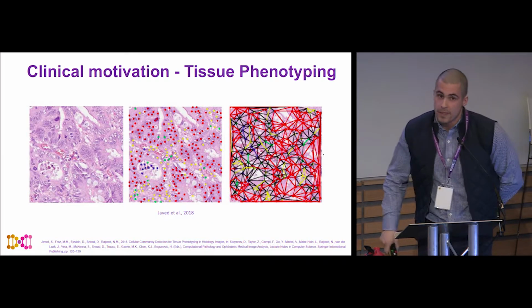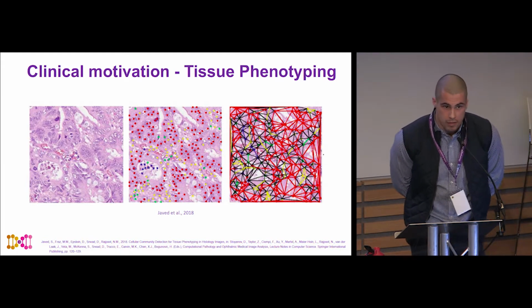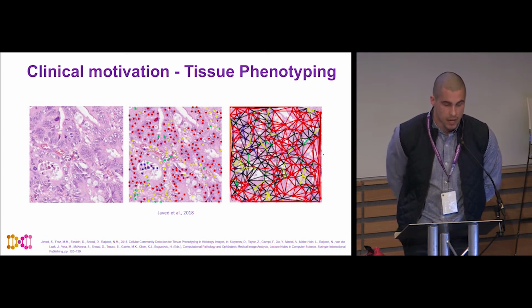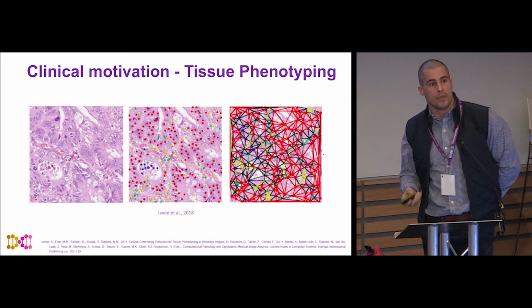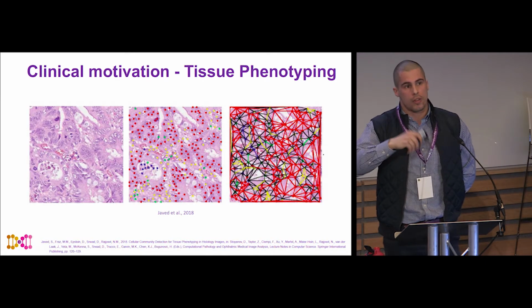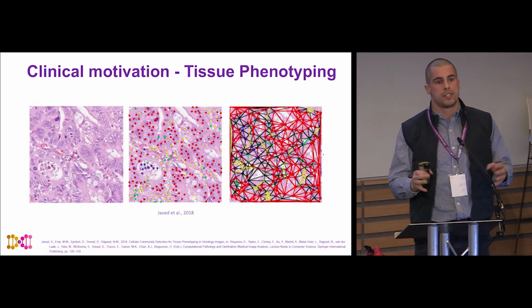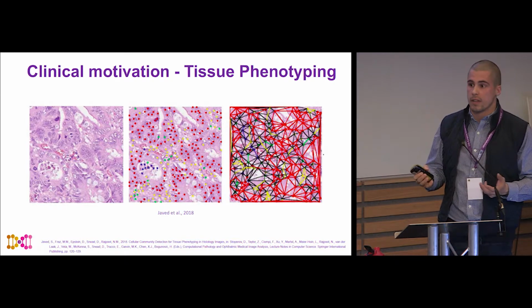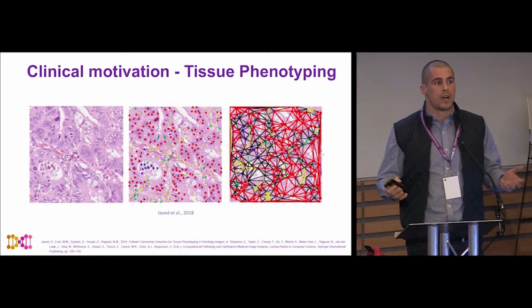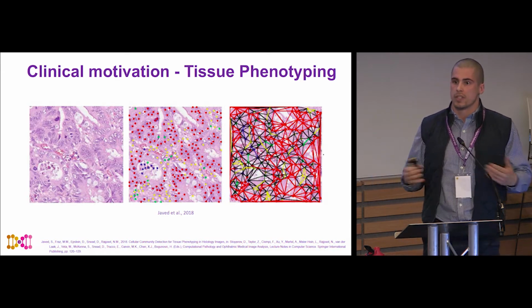Oh, okay. So yes, you detect different nuclei, you classify them, and then you construct a graph based on the connections between the nuclei. Based on that, there seems to be an issue with an image in the slides. Okay, you construct the graph. Based on that graph, you are then able to do community detection on the whole slide image, and based on those communities, you are able to identify different tissue subtypes within the whole slide image. And that allows you to provide essentially unsupervised annotation for the whole slide image and discover all of the tissue subtypes within the specific tissue.